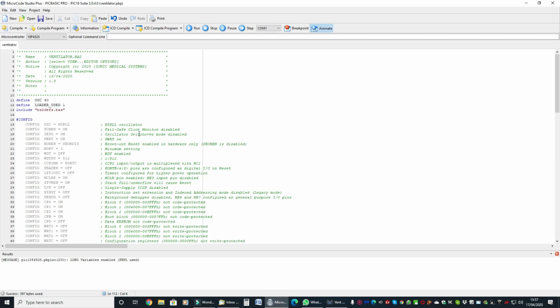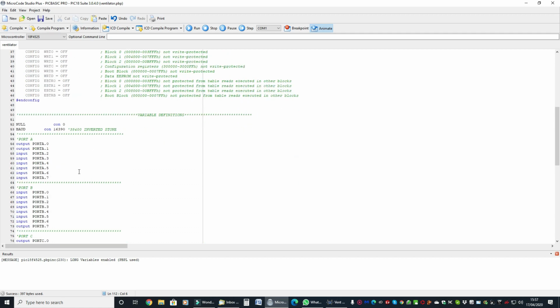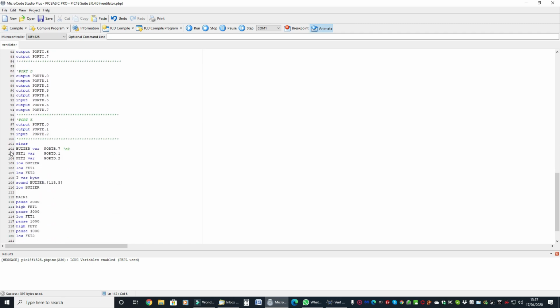We're going to be using PIC Basic Pro, which is one of my favorite languages, interpreters. Here we've got some basic configuration switches for the microcontroller. We've got the port setting for the display. Here we've got the port directions, whether they're inputs or outputs. Then we have an alias here. Buzzer is basically port B.7 in the code. FET1 is basically port D.1. FET2 is basically port D.2.